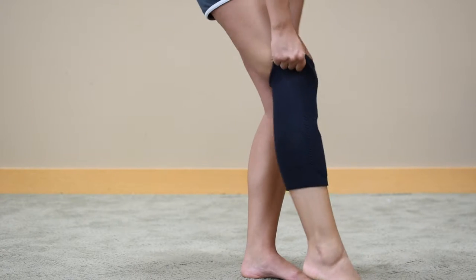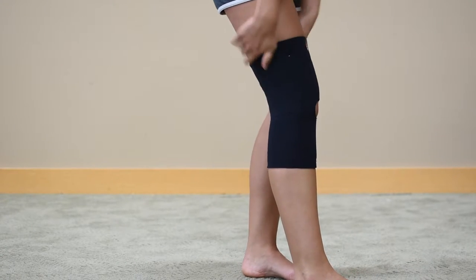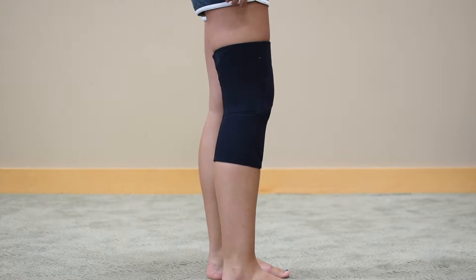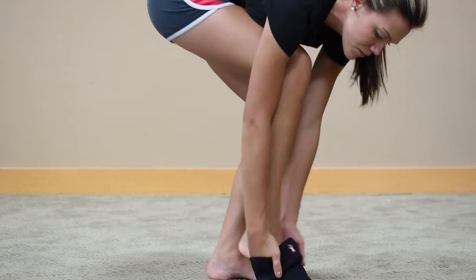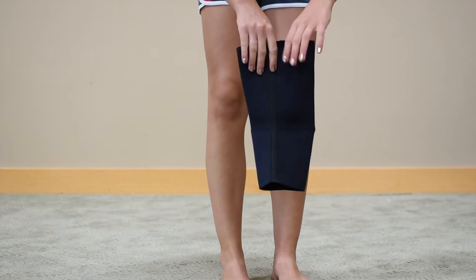Neoprene Knee Sleeve. A convenient slip-on support great for edema or post-surgical effusion, mild osteoarthritis, and patellar tendonitis, also known as jumper's knee. It has high-quality neoprene that delivers uniform compression and warmth, promoting circulation and helping to reduce inflammation.